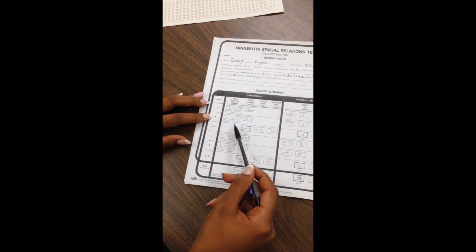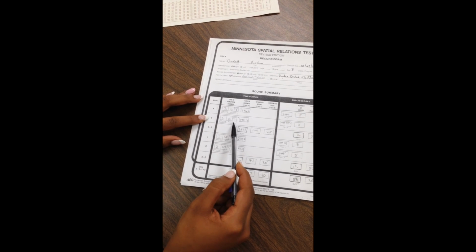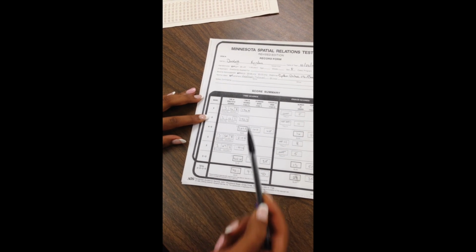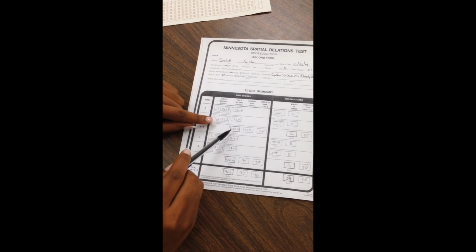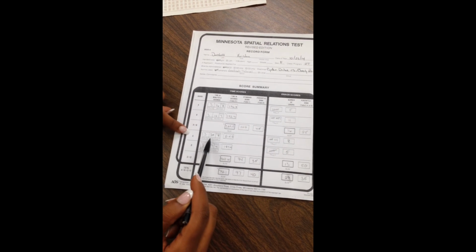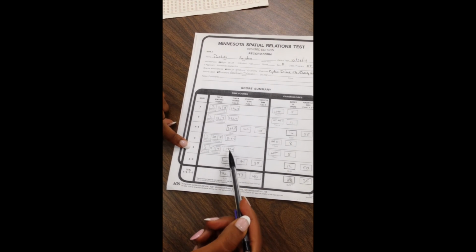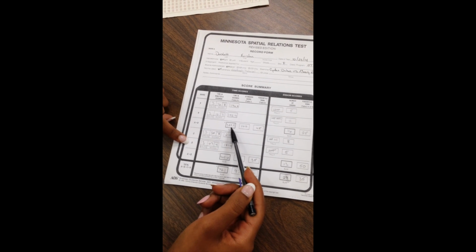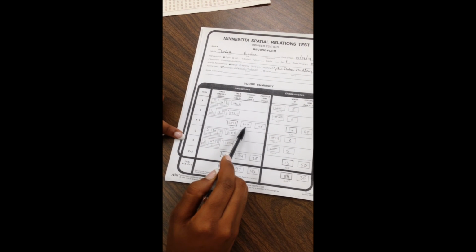You do the same thing with board B. Kristen took 3 minutes, 12.7 seconds to complete board B, and converting those minutes into seconds, she has 192.7 seconds. And then you add your seconds for boards A and B and get your sum. Follow suit with board C and board D, converting your minutes into seconds. Once you've done that, you take your second sum and refer to table 1 to get your standard score.